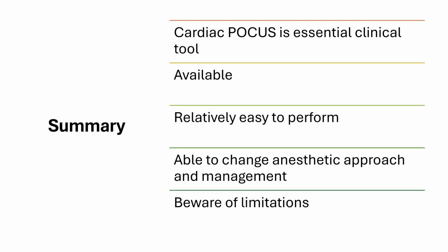So in summary, cardiac point of care ultrasound is an essential clinical tool. It should be readily available and relatively easy to perform. It has the ability to change anesthetic approach and management, and it is important to remember its limitations.